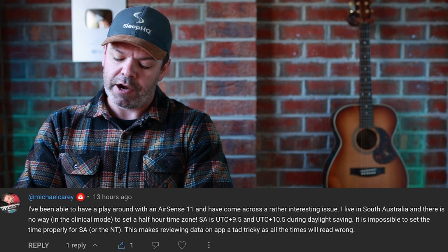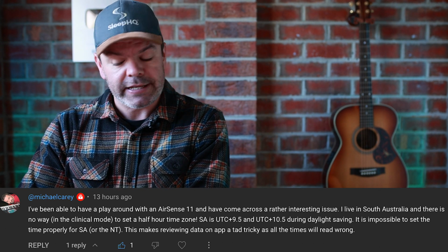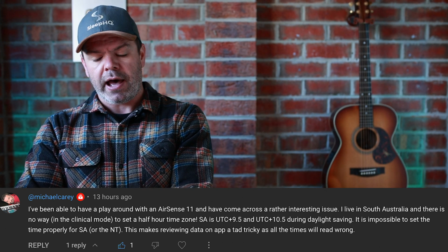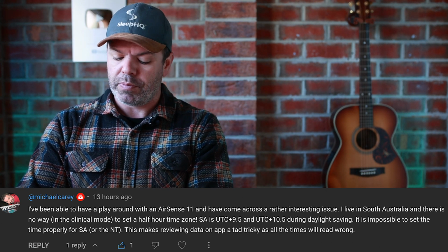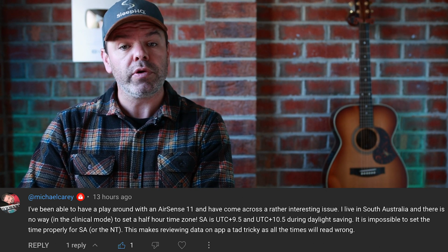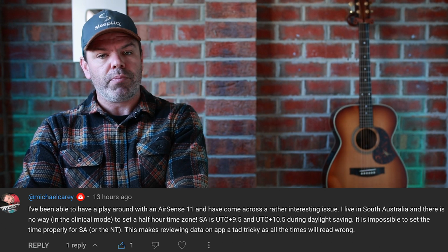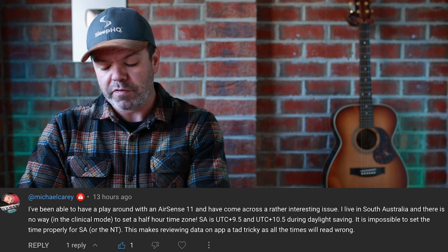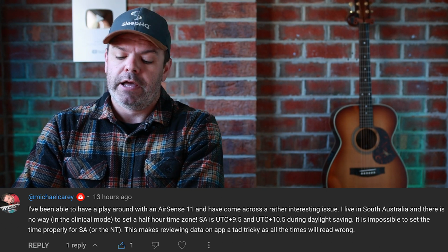G'day Michael. And he writes, I've been able to have a play around with an AirSense 11 and have come across a rather interesting issue. I live in South Australia and there is no way to set a half-hour time zone. South Australia is UTC plus 9.5 and UTC plus 10.5 during daylight savings. It is impossible to set the time properly for South Australia and the Northern Territory. This makes reviewing data very difficult as all the times are wrong.